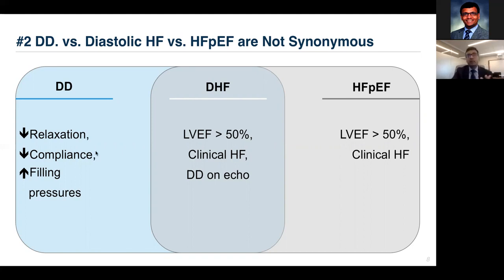Diastolic heart failure, on the other hand, means that typically the patients are presenting with a milieu that suggests elevated filling pressure, and you can see the features of diastolic dysfunction as identified using echocardiography or invasive cardiac catheterization studies. Now, there are other patients who have completely preserved ejection fraction and who have clinical features of heart failure, and some of them may not have echocardiographic criteria to suggest diastolic dysfunction.